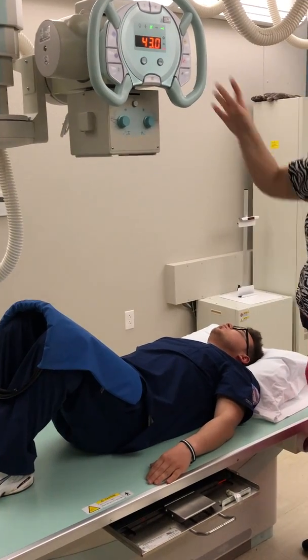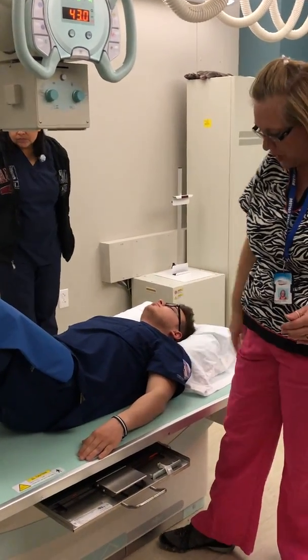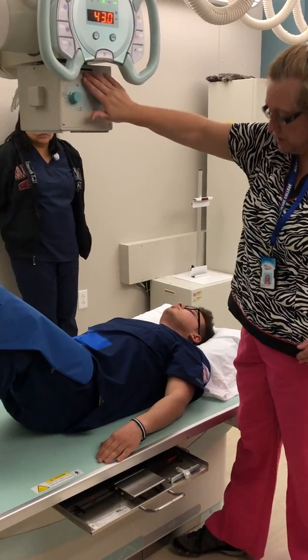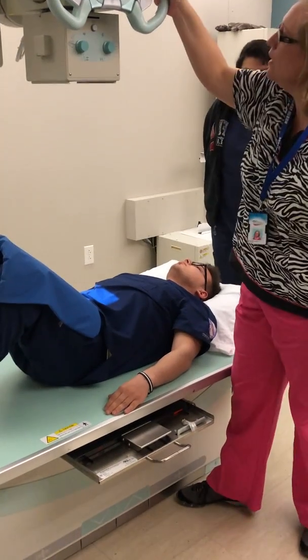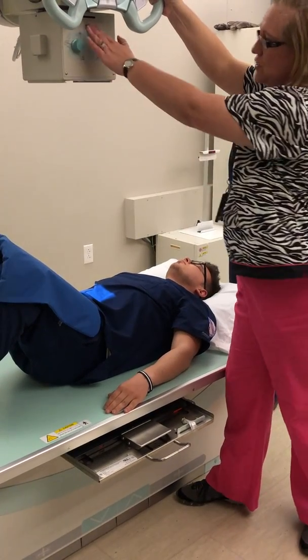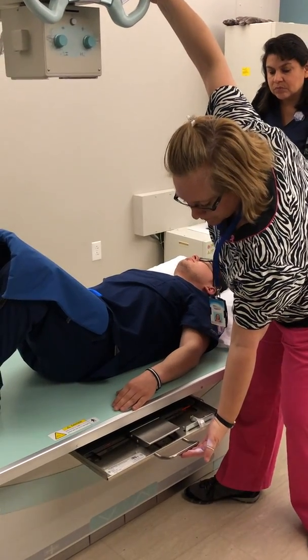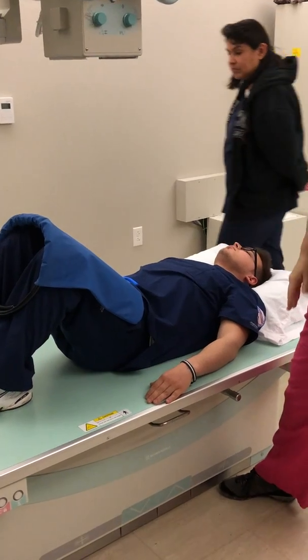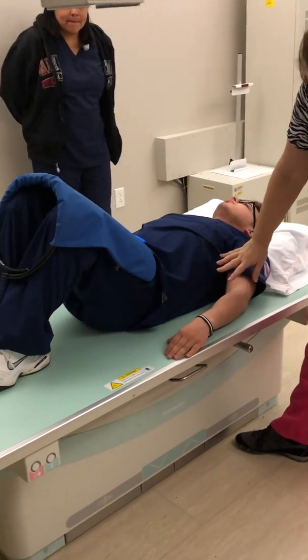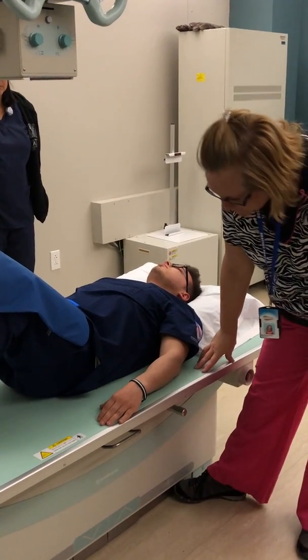Now with this equipment, we're kind of limited as to the range of the Bucky. So I want to make sure, you can see the light field here, that I have the tube and the Bucky in alignment here. Once I have the tube and the Bucky in alignment, I can now move the patient by moving the table. So the table is going to move.